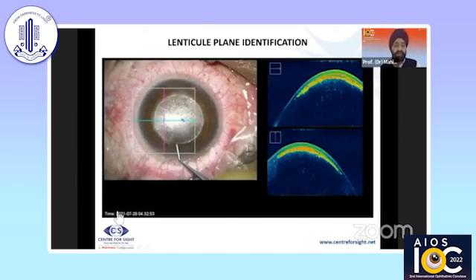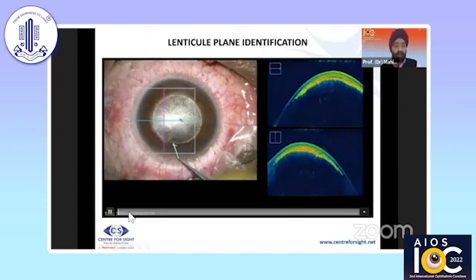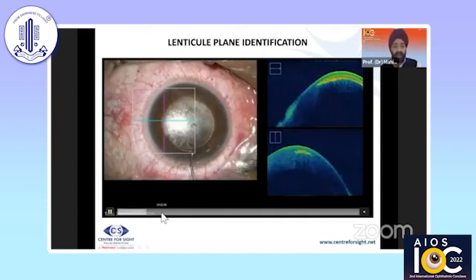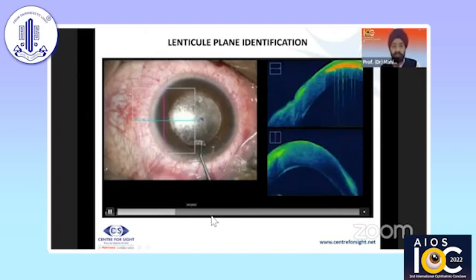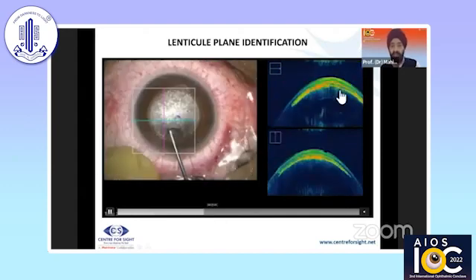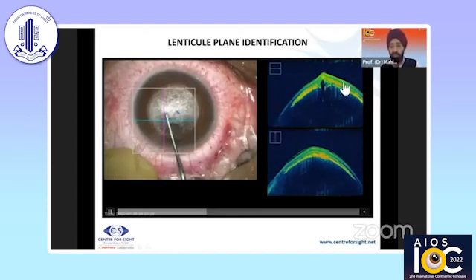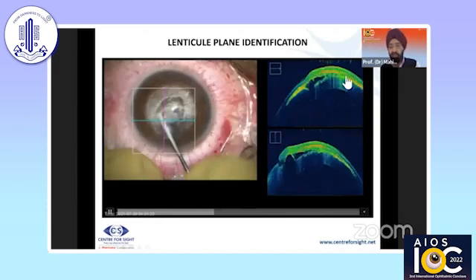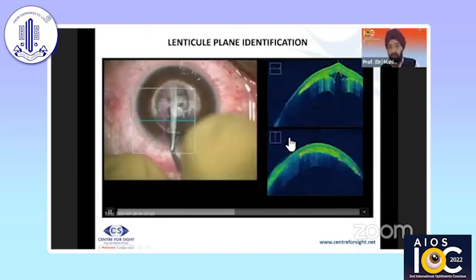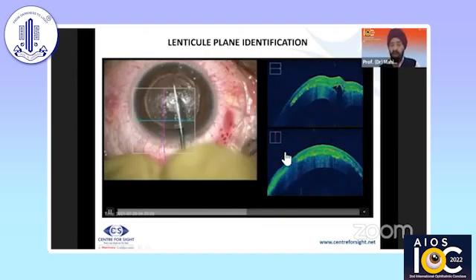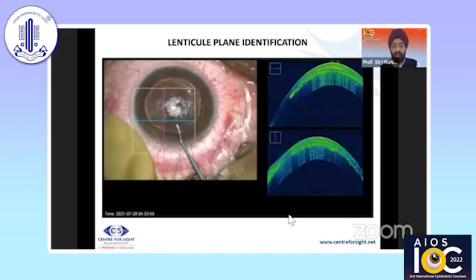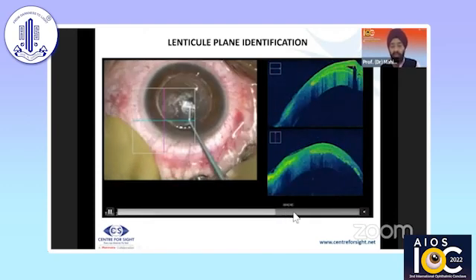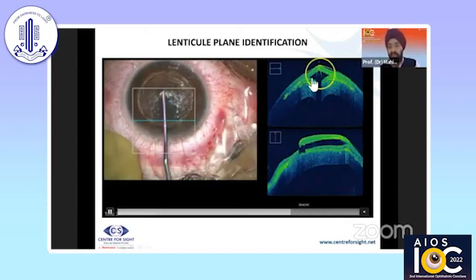This is lenticule plane dissection as seen on intraoperative OCT. You can see we are entering, and in this particular case we have gone into the posterior plane — you can see that clearly. This is the lenticule, but we have not gone into the anterior plane. So wrong-plane dissection can easily be identified on the OCT. We then go into the anterior part of the lenticule and again you can see the anterior part clearly — a very good image.